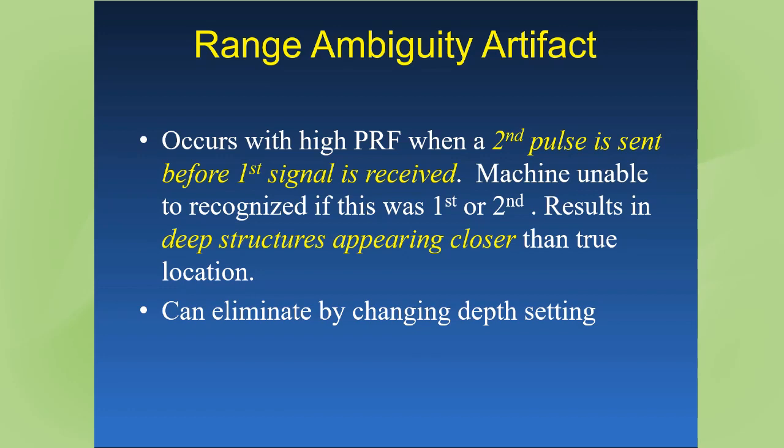Now, this can be eliminated by changing the depth setting. And by changing the depth setting, we decrease the PRF. And so the pulses aren't sent out as fast, and we can change that relationship of coming back. And I'll actually show you an example of this, but this is a really neat one.